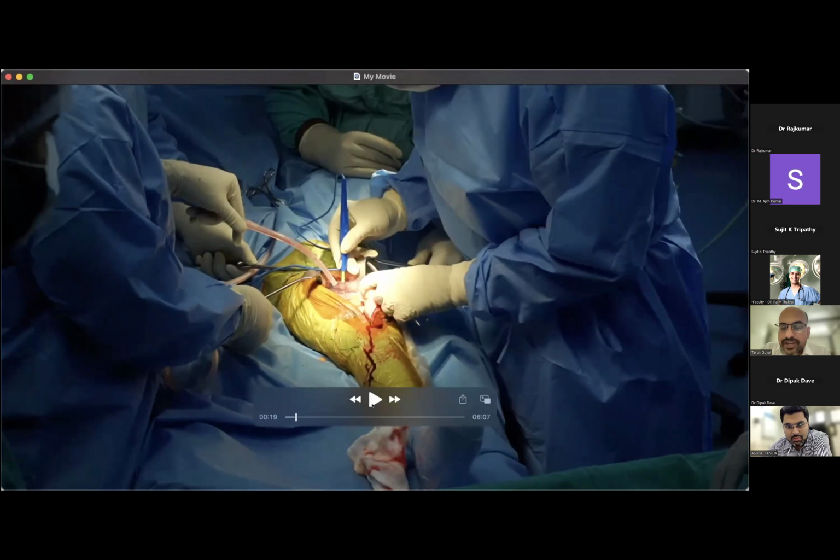So this is articulating with the femur, as well as it has a broad extension in the suprapatellar area, just to prevent adhesion, so that the future exposure becomes easy. So this extends also to the medial and the lateral gutters around the femur, and also the suprapatellar area. And once we remove this spacer, we really don't have to dissect a lot to create the gutters on the medial and the lateral side again.